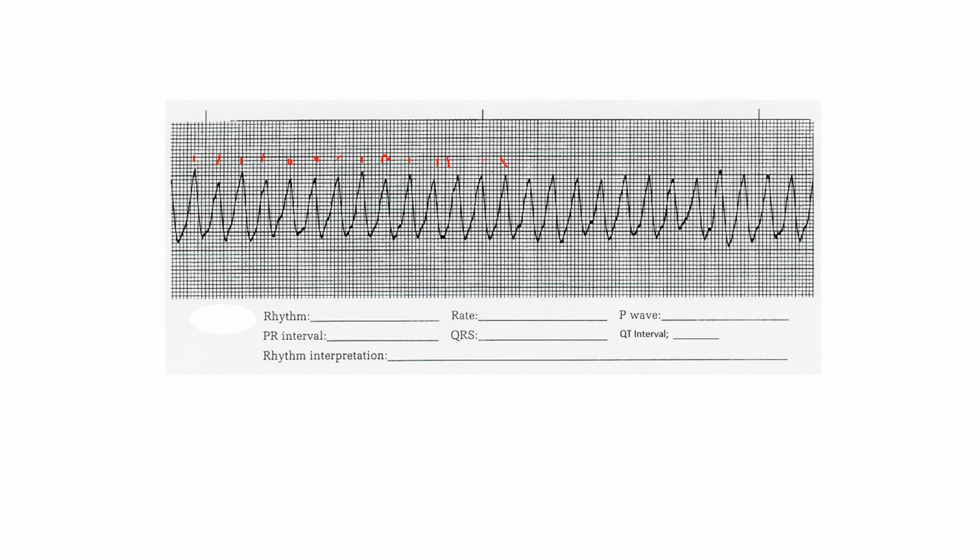So that's why you always use sync when your patient has a pulse, because you don't want to make the rhythm worse. You want to hopefully convert the rhythm. So this is unstable VTach, and we are going to synchronize cardiovert.